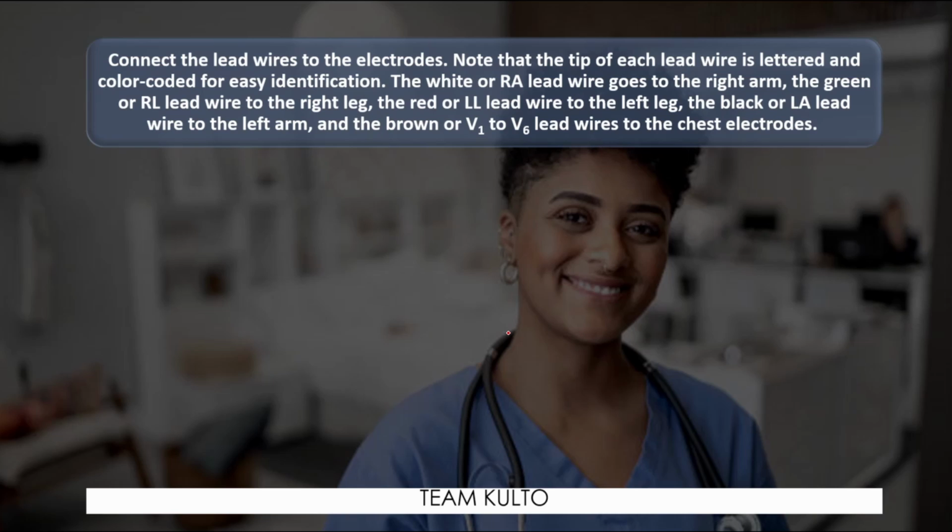Connect the lead wires to the electrodes. Note that the tip of each lead wire is lettered and color coded for easy identification. The white or RA lead wire goes to the right arm, the green or RL lead wire to the right leg, and the red or LL lead wire to the left leg, the black or LA lead wire to the left arm, and the brown or V1 to V6 lead wires to the chest electrodes.